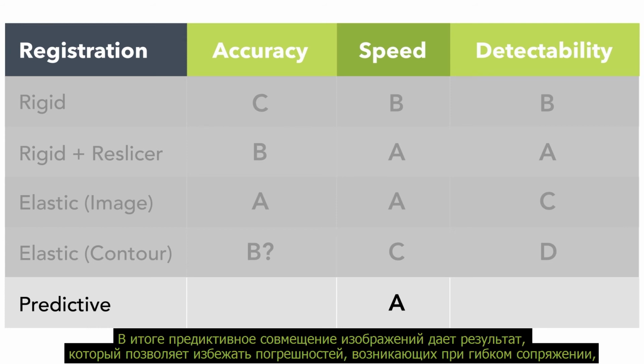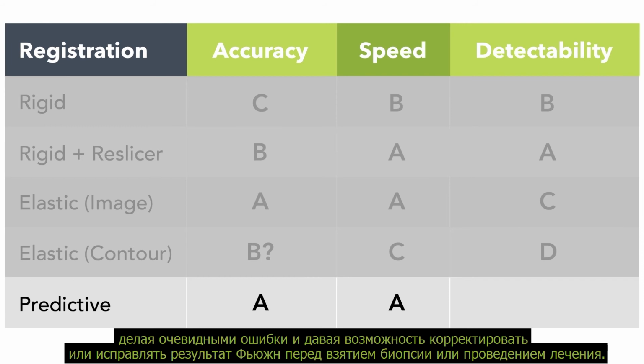In the end, Predictive Fusion gives you a result which avoids the uncertainty of elastic registration while making errors plain, allowing you to adjust or correct before taking a biopsy or delivering treatment.